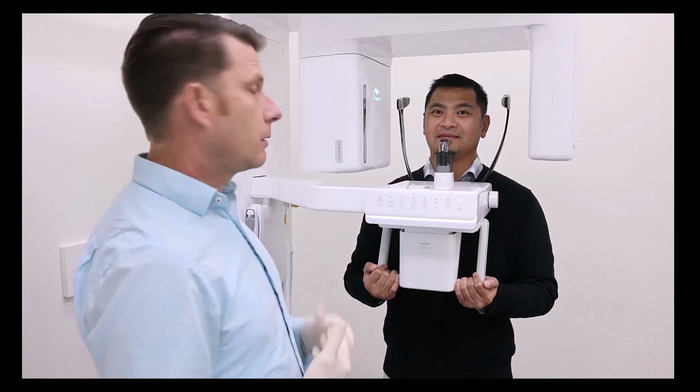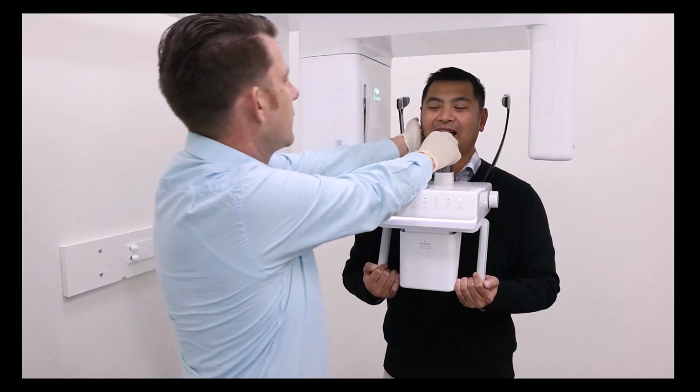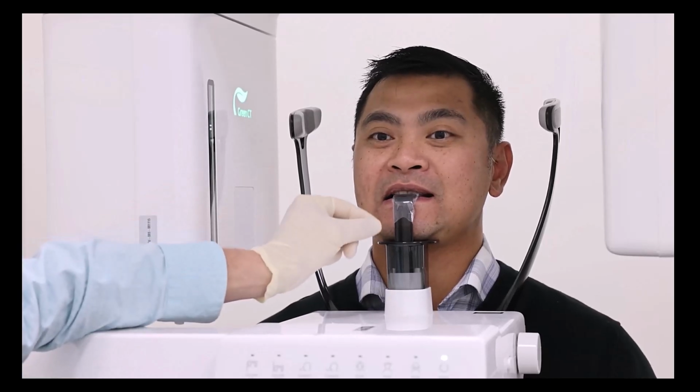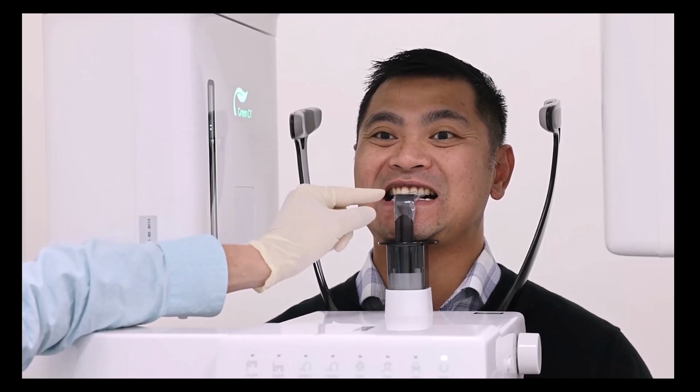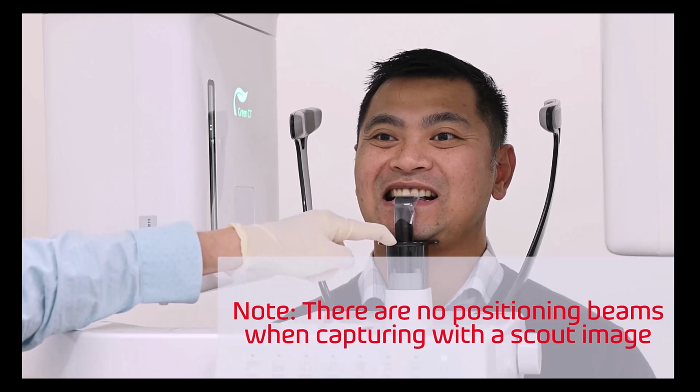So I have my patient positioned. I'm going to have them bite on the bite stick. Go ahead and come forward. So I have my patient in the machine. I can see they're in the bite stick groove. I'm going to push down to ensure their chin is firmly on the chin rest.